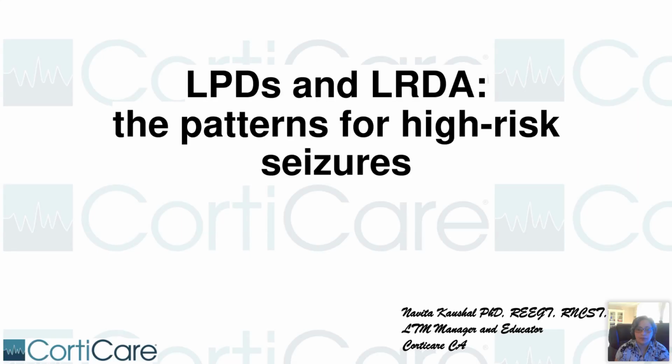Good evening, everyone. I'm going to get started. So we're going to talk about lateralized periodic discharges and lateralized rhythmic delta activity. These two rhythmic and periodic patterns are associated with seizures.